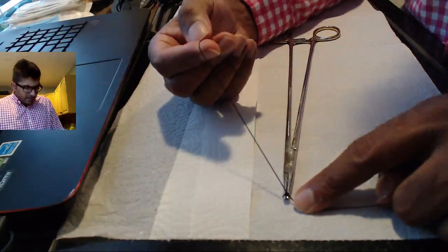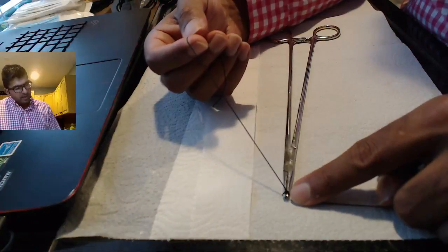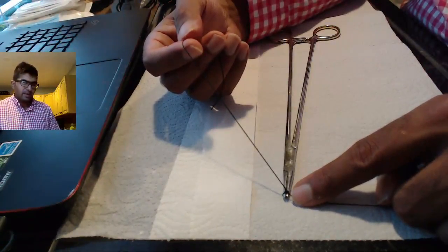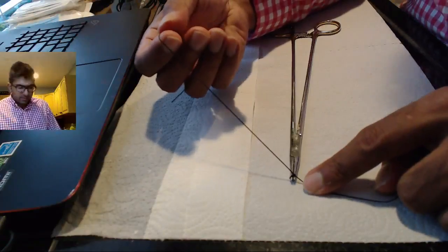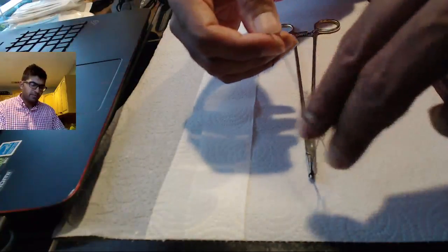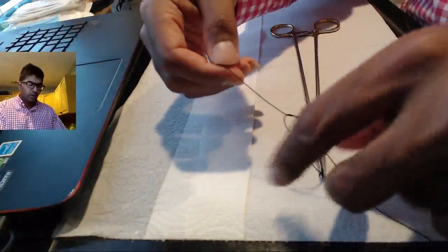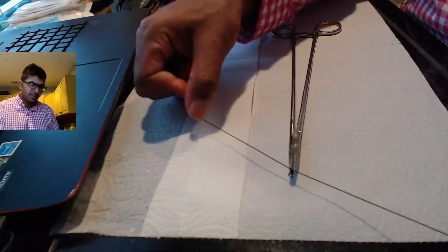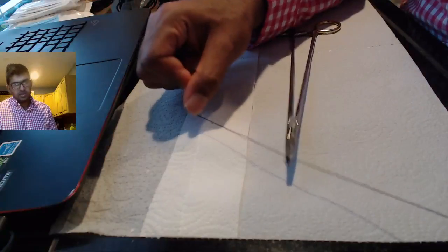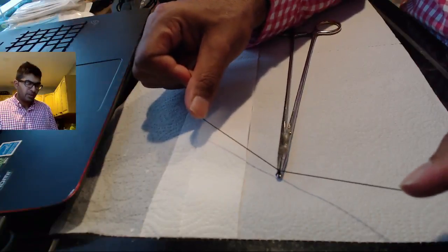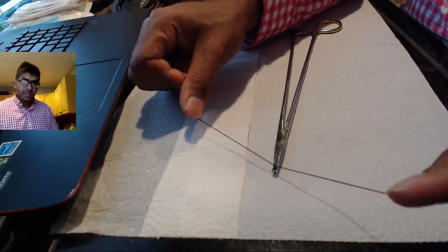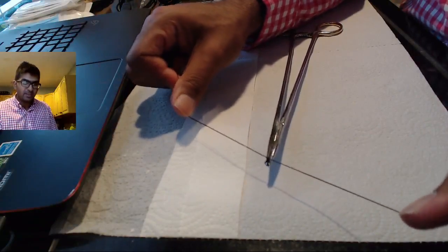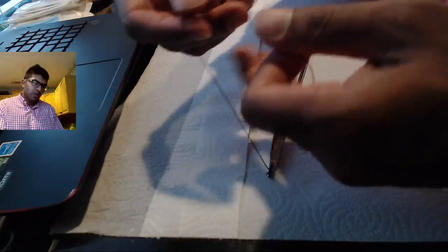So, this is a pet peeve of mine, and I think it doesn't matter so much with this suture, because it's hard to break. But when you start getting with 5-0s and 6-0s, you'll notice people that haven't been used to bringing the knot down will actually break the suture. And I'm going to teach you right now how to prevent this from happening. So again, throwing a forehand. Here's a forehand. And what people do is that they just bring this to the side. And by doing this and then pulling, you're just asking for that smaller suture to be broken. Why? Because you're expecting this lateral force to bring the suture down. And what you notice is that as I pull hard enough to get the knot to sit tight, that my instrument is lifting up. So, in a delicate artery or vein, or in a tissue that's friable, by pulling to the side, you can actually rip that tissue and, unfortunately, make your hole bigger.